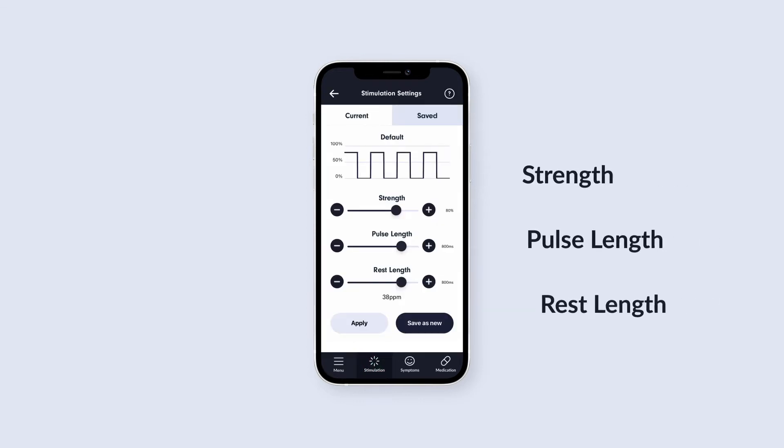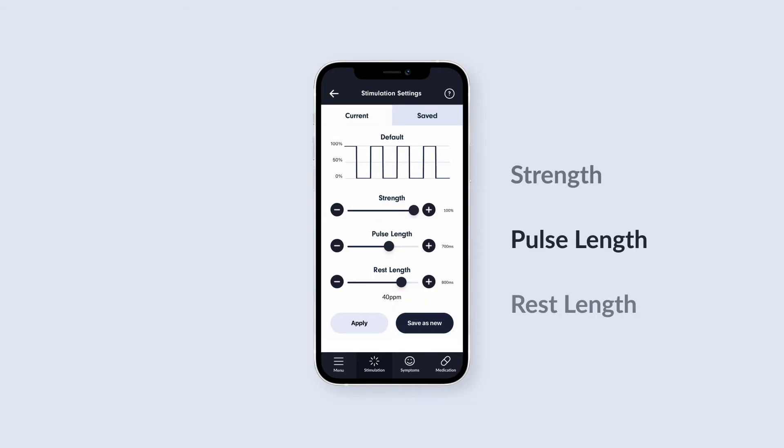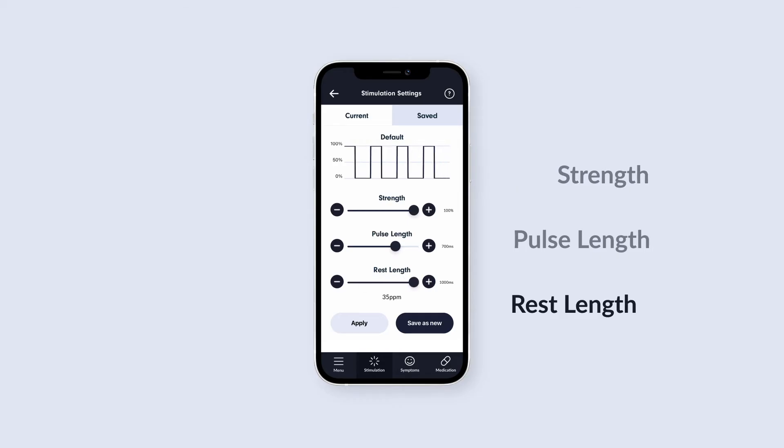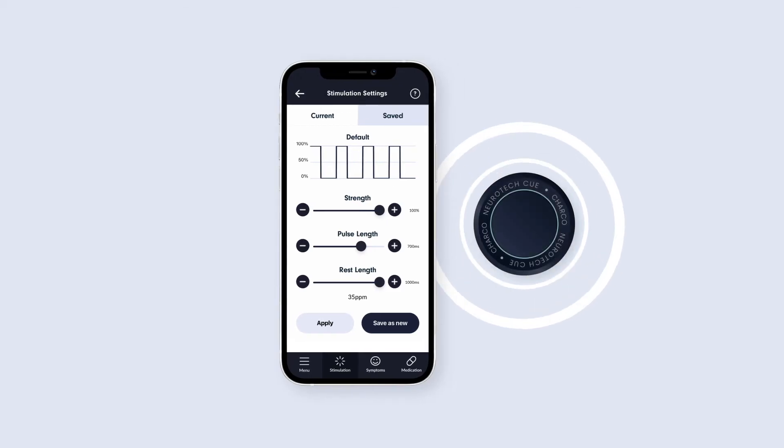Here you will see three sliders that you can tap and drag to increase or decrease. Strength adjusts the intensity of the vibration. Pulse Length sets how long each pulse of vibration is, whilst Rest Length sets how long the gap between each pulse is. These changes are shown visually on the graph at the top of the screen, which represents the pattern of the Q1 vibration.